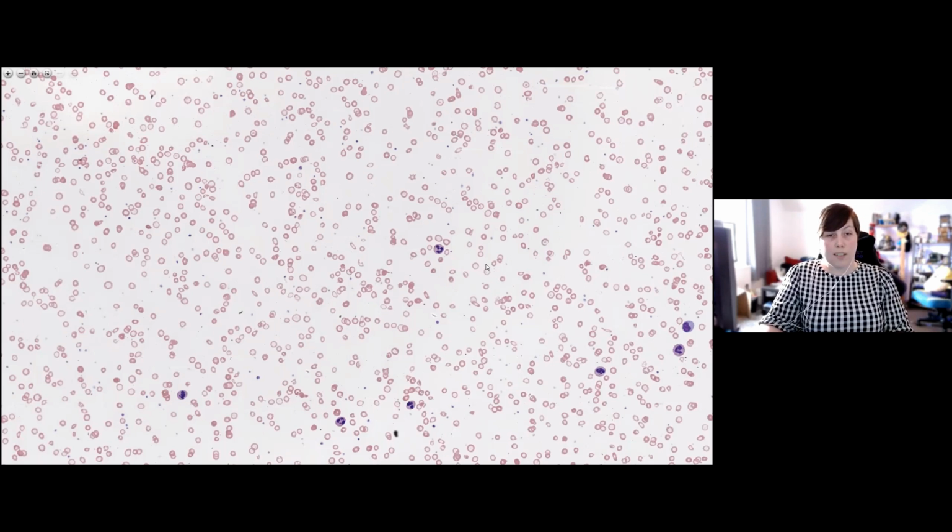We want to look at red cell shape. And we also want to look at what I call some big picture things. Big picture things are things like rouleau, where you have a coin stacking appearance to the cells, agglutination, where you have clumps of cells sticking together, and things like proteinaceous background, where you have a blue kind of appearance to the background of your film.